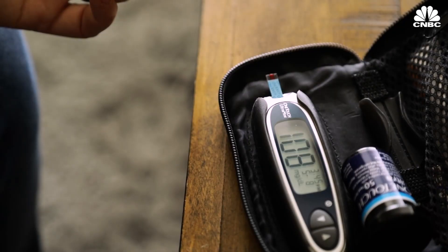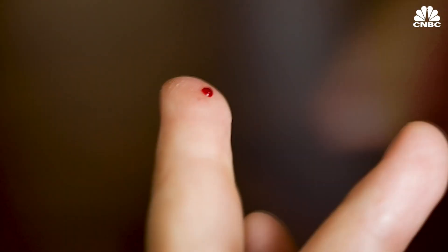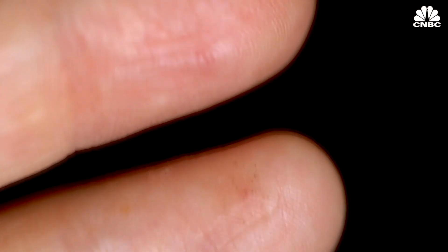Over a million Americans have type 1 diabetes. I've had the disease for over 20 years. Each day I check my blood sugar 5 to 10 times, which means I've pricked my finger 70,000 times.